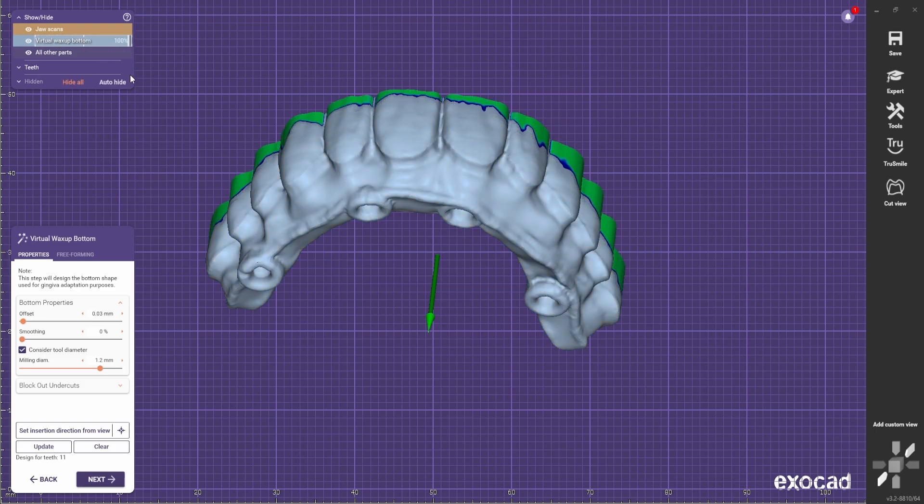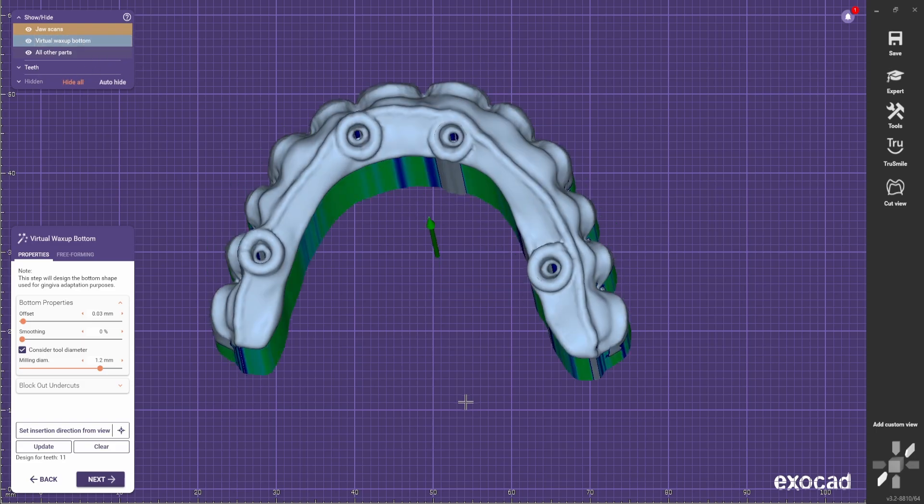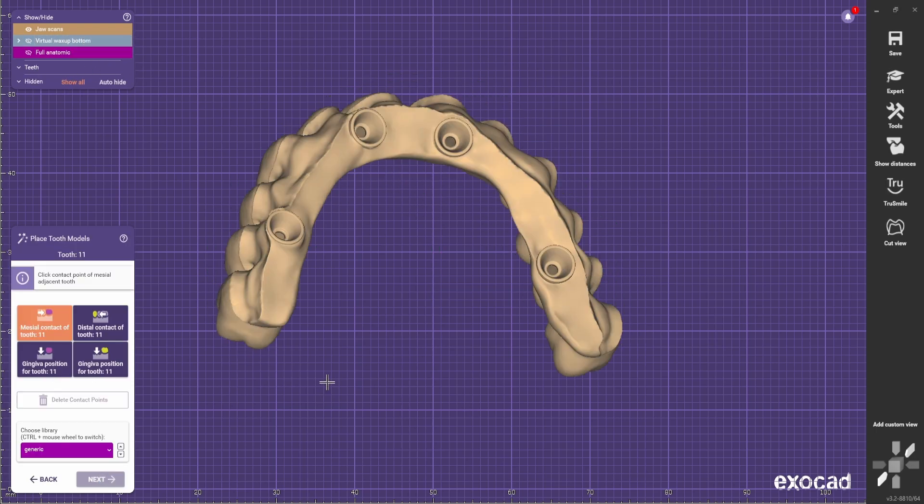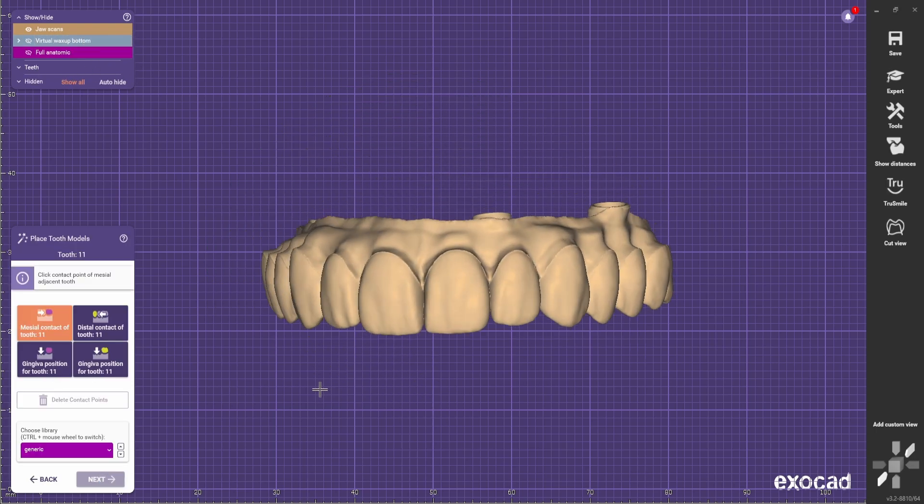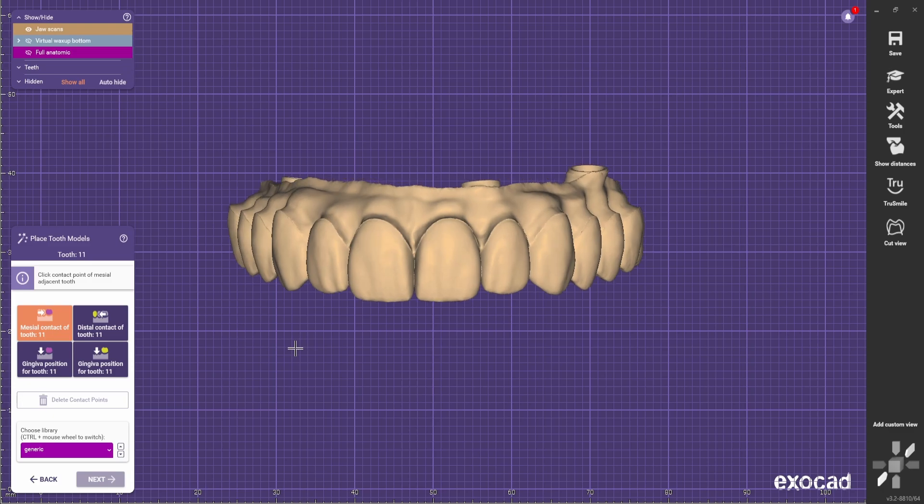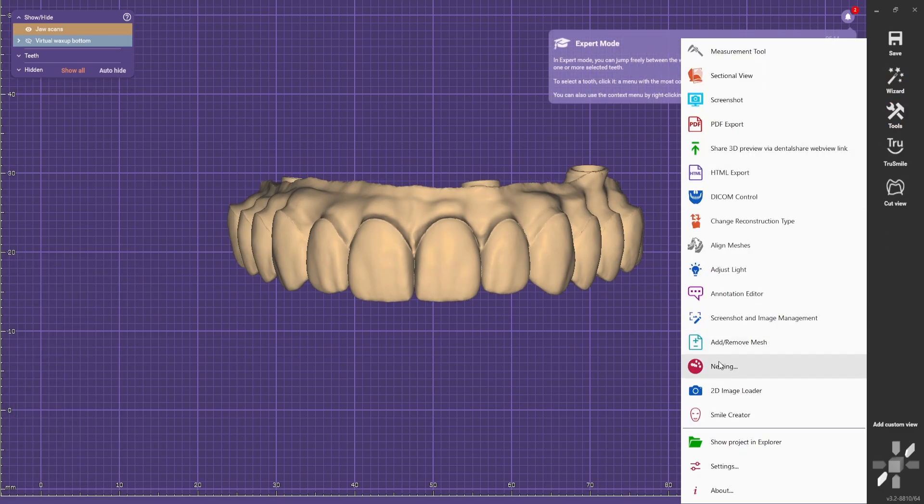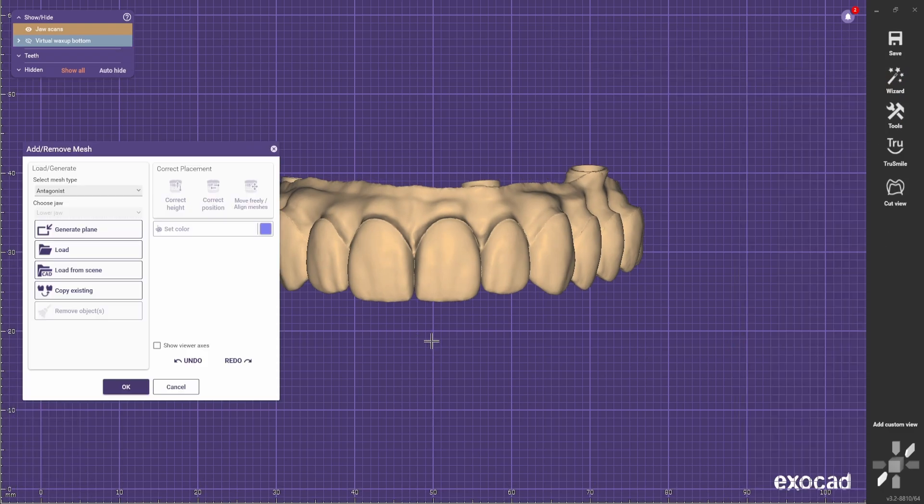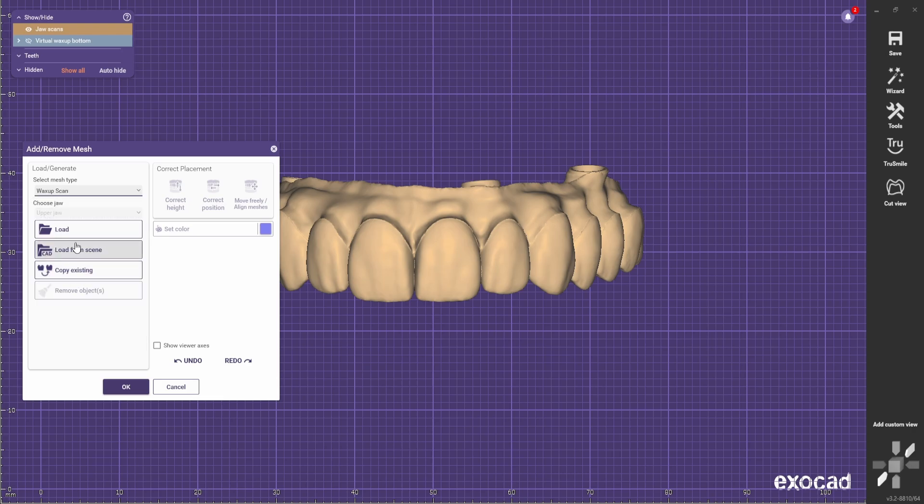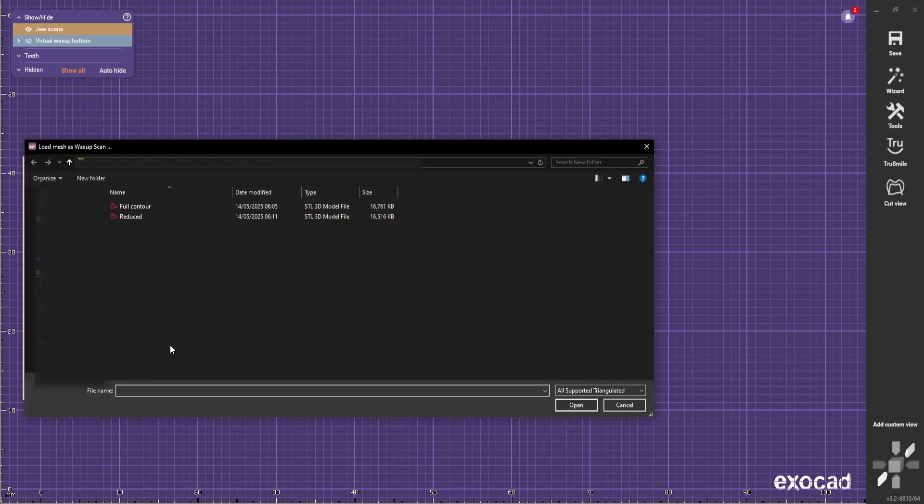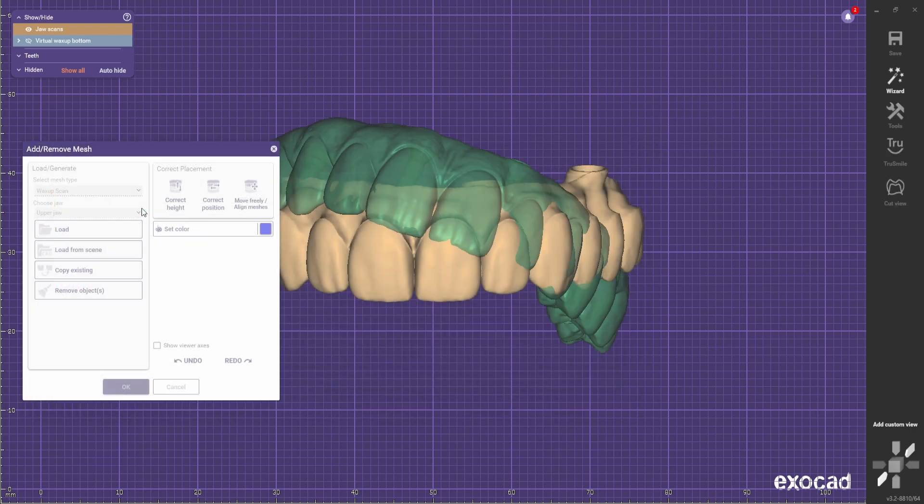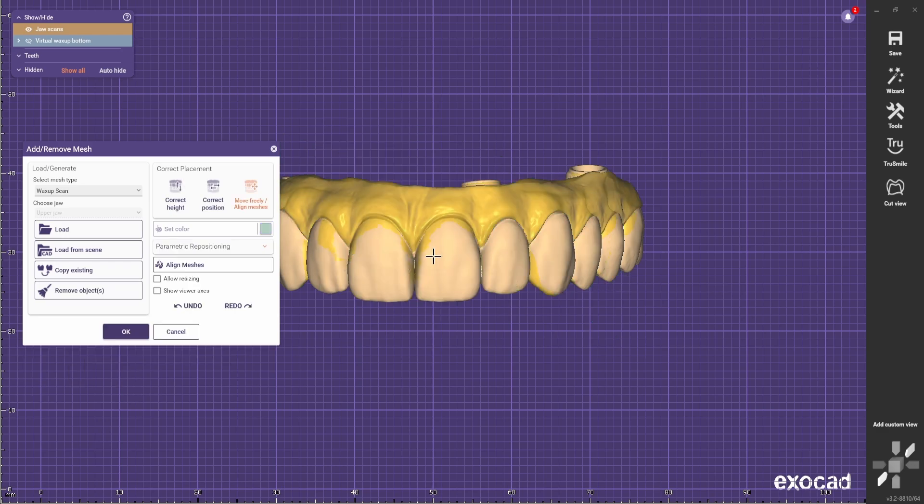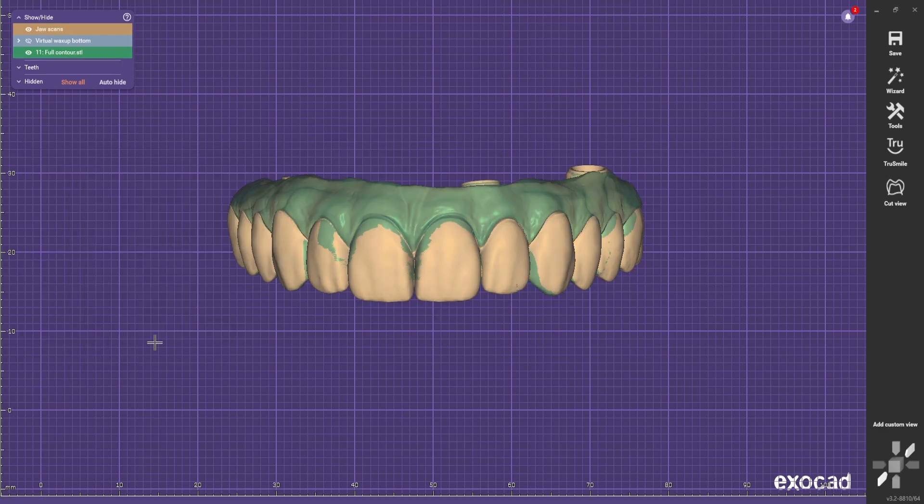You're gonna have something like this. Go next. And now when he asks you to do the Mockup, you go to expert mode, go to tools, add remove mesh and you bring the Mockup scan. And then bring the full contour and select yes. Press OK.